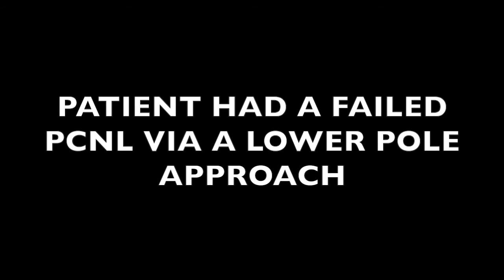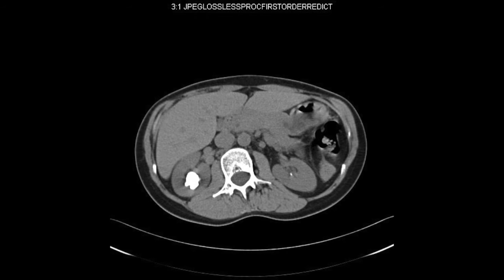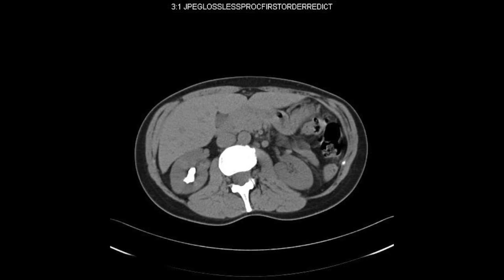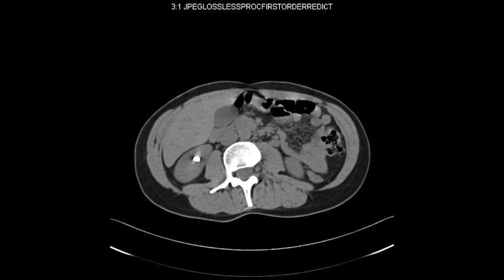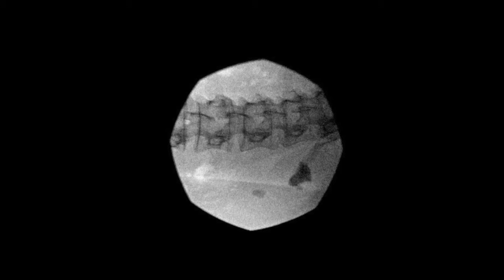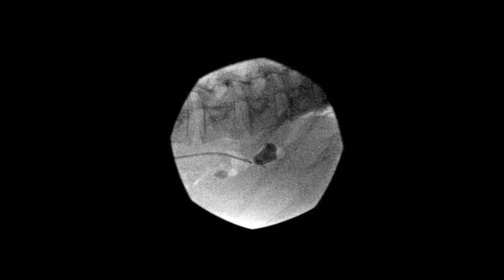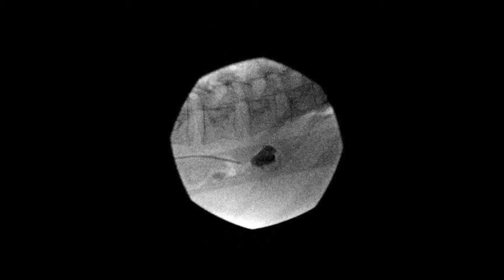This final case highlights several other key pearls for PCNL. This patient came to me after an outside urologist had failed a PCNL through a lower pole approach and actually suggested she undergo a laparoscopic pyelolithotomy. As you can see on these CT images, her stone burden is clearly best accessed through an upper pole access. When we approached this case in the operating room, that was our initial plan — to come in through the upper pole to clear her maximal burden of stone, as you can see on this scout image from the operating room. Our air pyelogram also showed that the stone was readily situated in a posterior calyx.